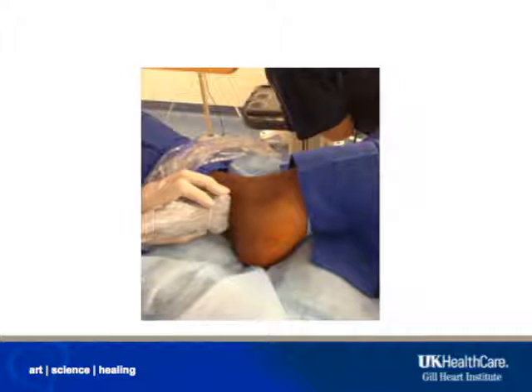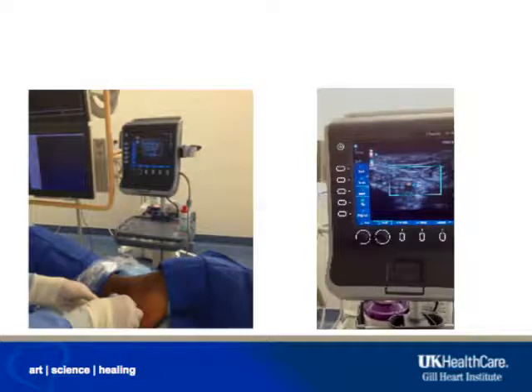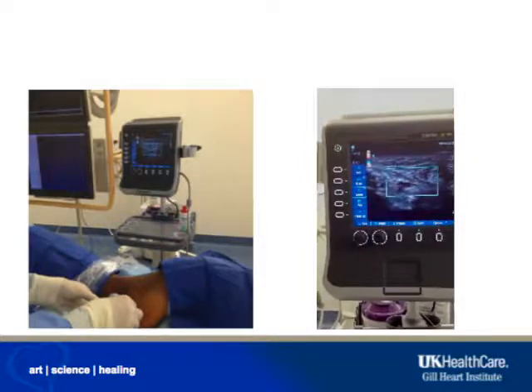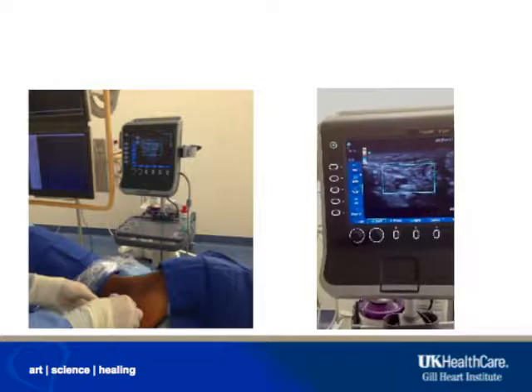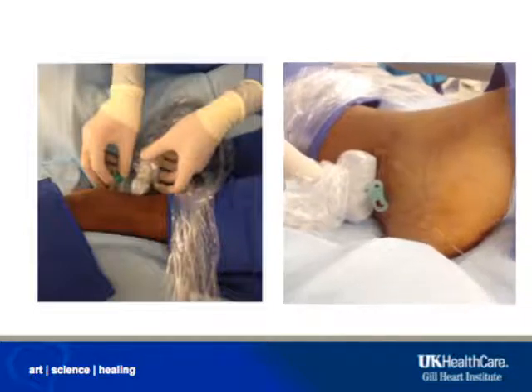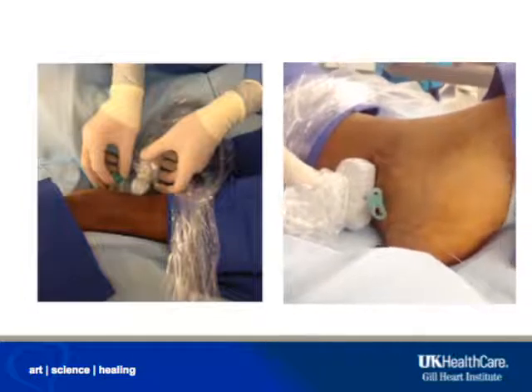The medial malleolus is the landmark used. The ultrasound probe is positioned posterior to the malleolus. Real-time ultrasound visualization allows for identification of the vein and artery, which lie parallel to one another. Color Doppler imaging is key to identifying arterial and venous flow. The vein is also more easily compressed, thereby giving an additional identifying feature to confirm that the proper vessel has been selected. A 21-gauge micropuncture or radial access needle can then be inserted under ultrasound visualization and then confirmed with the appearance of non-pulsatile blood.